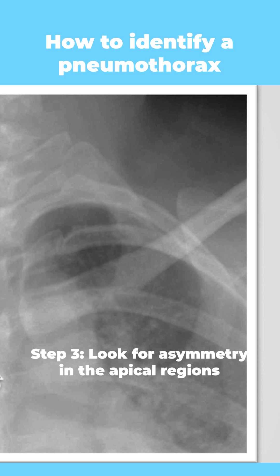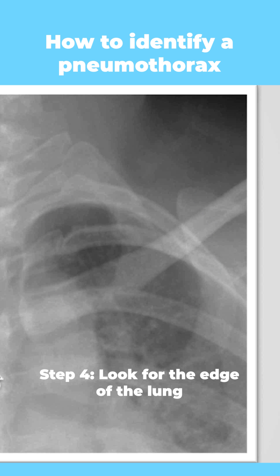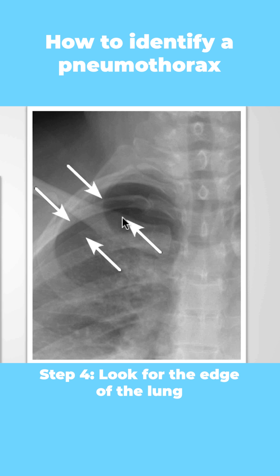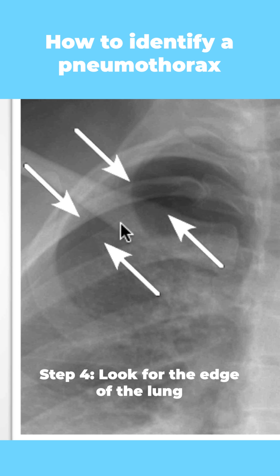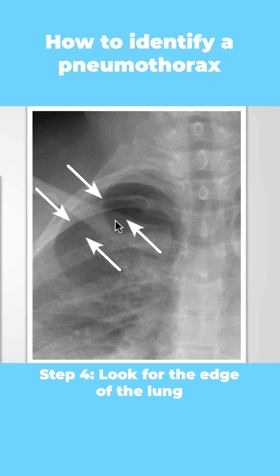The next step is to look for the edge of the lung. Here we can clearly identify a thin line which represents the visceral pleura. On this side of this line, there is increased blackness from the pneumothorax, confirming that this is a pneumothorax.